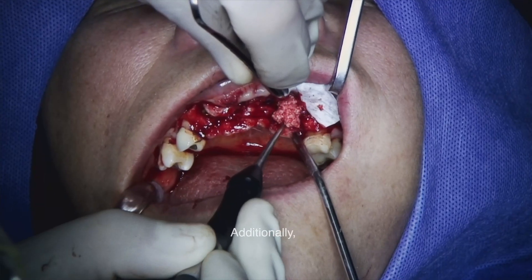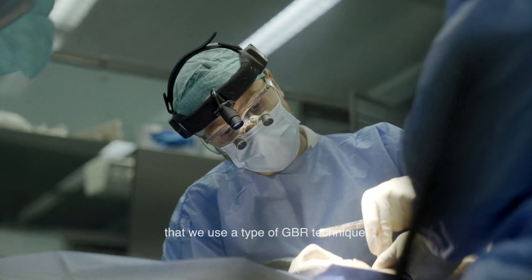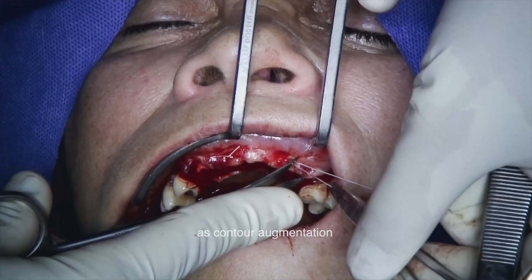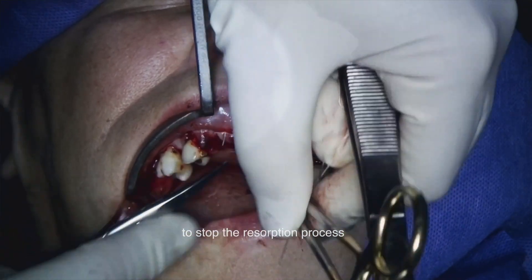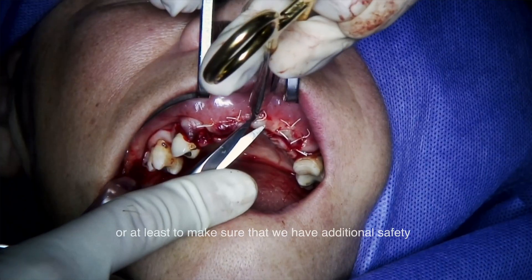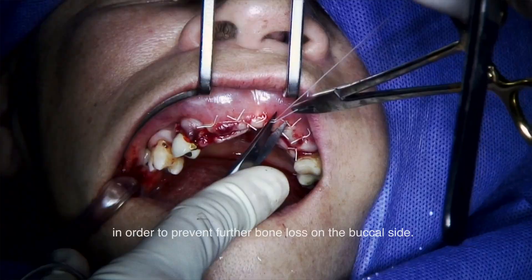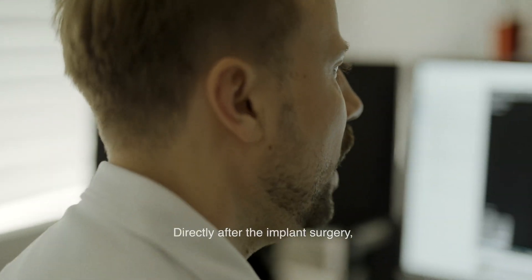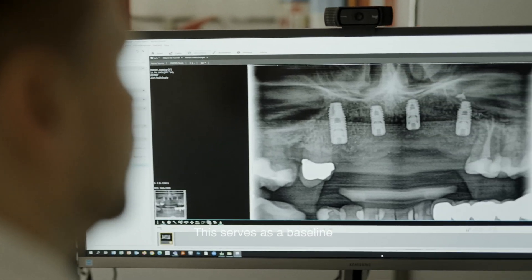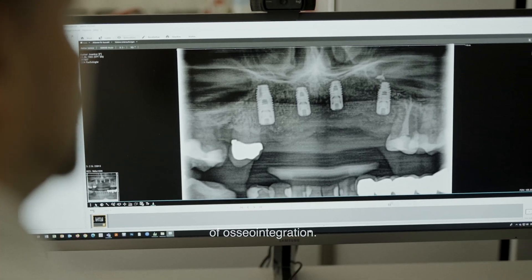With this allograft material, it is very important to use a GBR technique — a contour augmentation — to stop the resorption process or at least provide an additional safety margin to prevent bone loss on the buccal side. Directly after implant surgery, an OPG is taken as a baseline, followed by a five-month period of osseointegration.